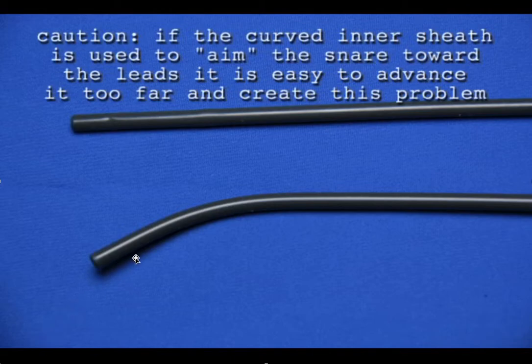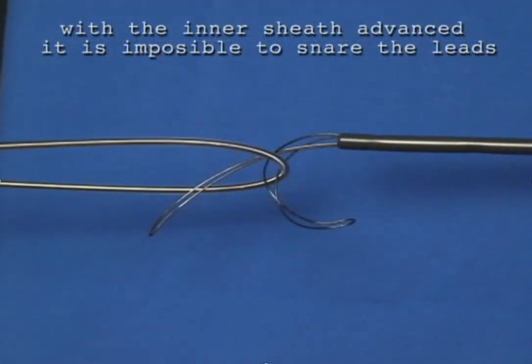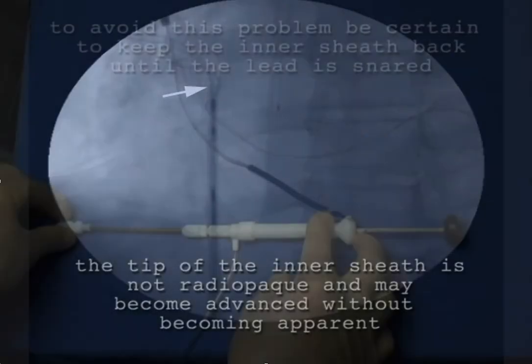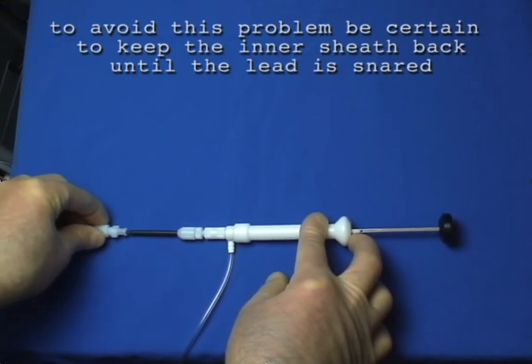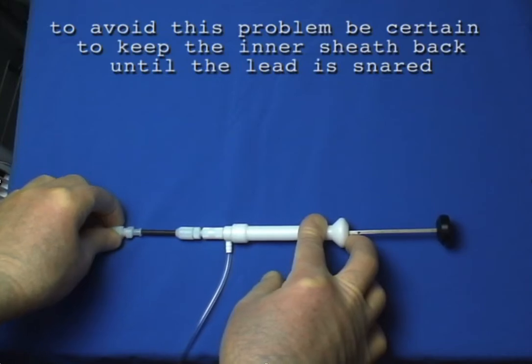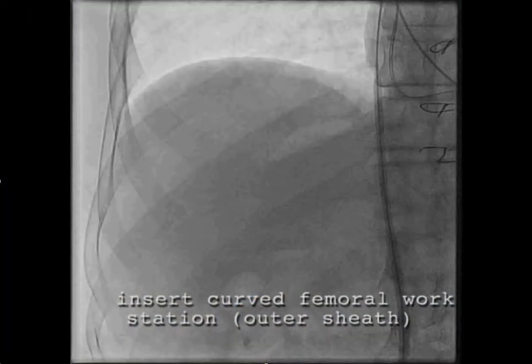And this is particularly problematic if you're trying to aim the snare using the curved inner sheath. And that's why I try to stay away from the curved inner sheath, because it's really tempting to slide that curved inner sheath up there to try to direct the snare where you want it to go. But if you do that, even if you manage to grab it, you're going to end up with a threader loop always going in the wrong place. So while you're trying to grab it, before you advance this plunger to extend the threader loop, you want to make sure that the inner sheath is all the way back, because you can really just drive yourself nuts with this.